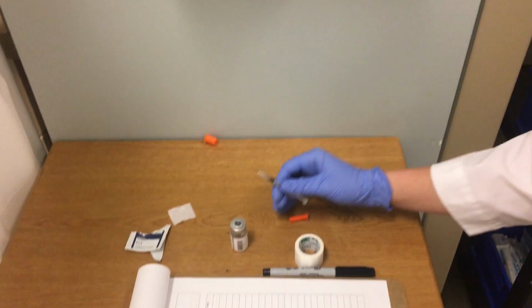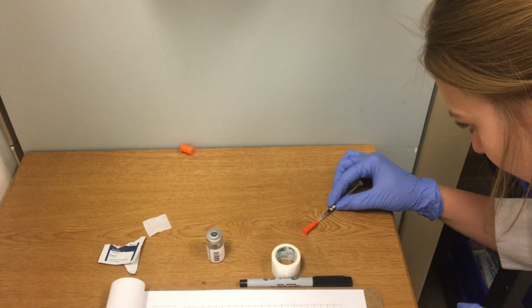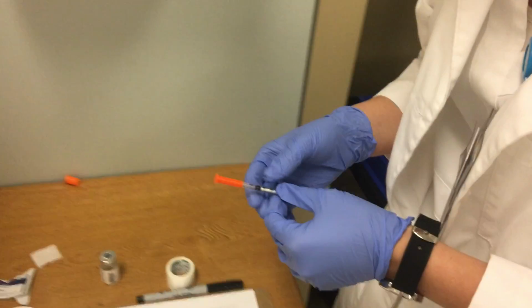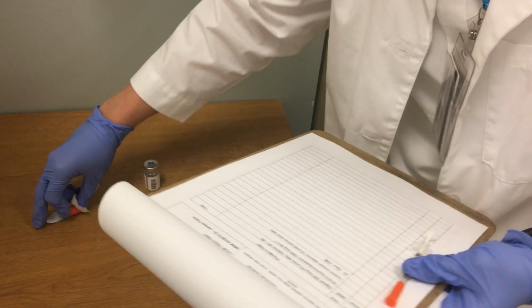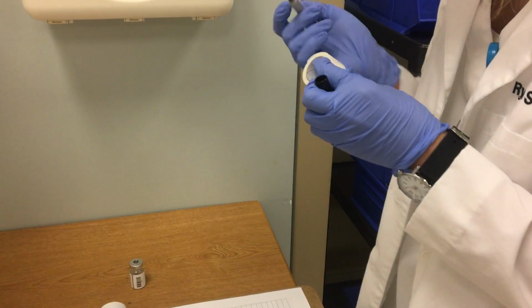And normally I would have another nurse come in and check the 5 rights of insulin. So the right medication, the right dose, the 10 units, the right patient before I administer, right route, and right time. So I'm going to go ahead and throw this stuff away before I get my other meds. And I'm also going to label this as 10 units for the other nurse to check.